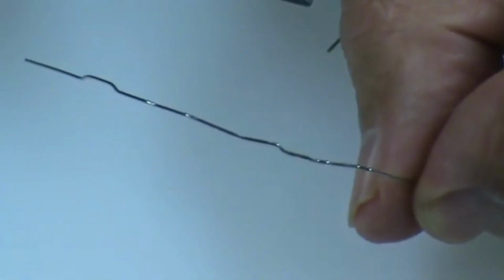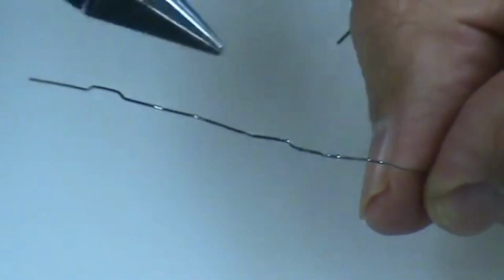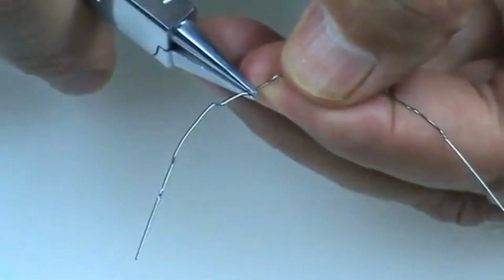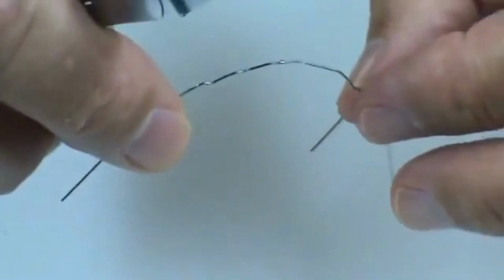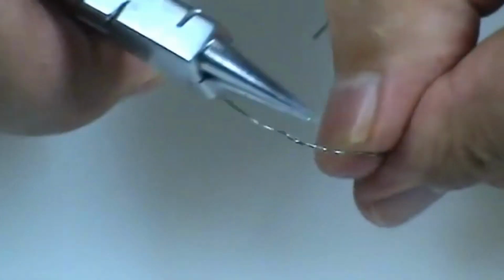So what we're talking about here is adding to an existing wire, and you act like the wire has no bends in it at all. You just mark the wire, make a step up where you think, ignore all the other bends, and I think maybe I'd probably make that just a little bit bigger than I made it on 3-1 distal. So again, the magnitude is you sort of looking in the patient's mouth how much the tooth needs to be moved. Okay, so I just made a little bigger bump right here on 3-1 distal.